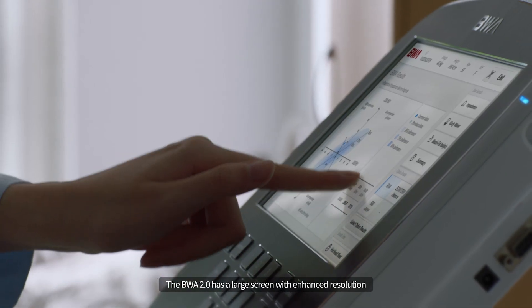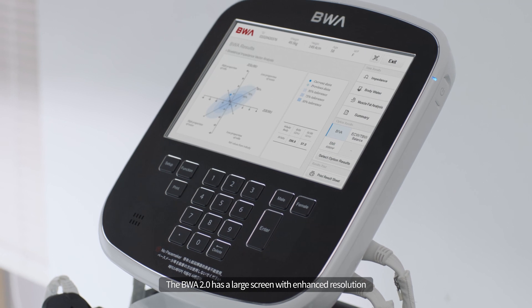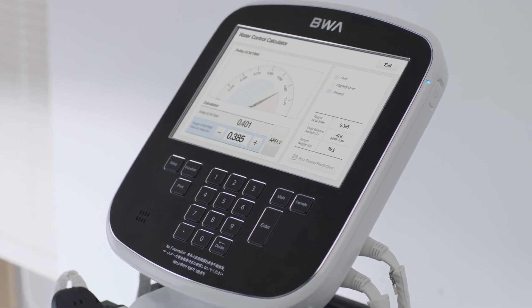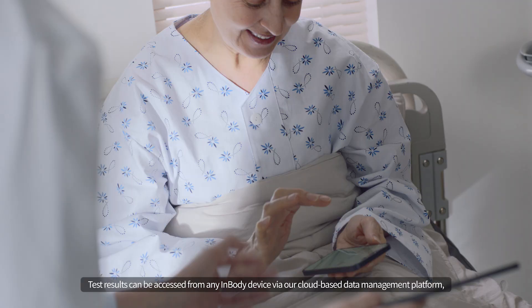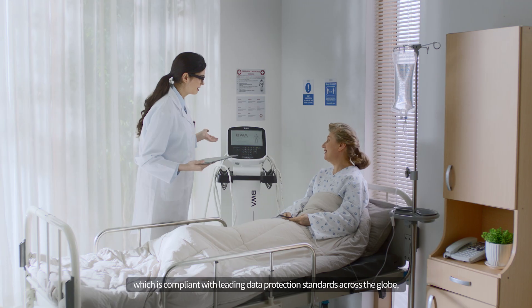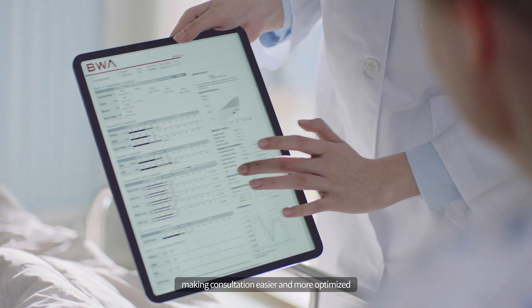The BWA 2.0 has a large screen with enhanced resolution that allows for the monitoring of test results on the spot. Test results can be accessed from any InBody device via our cloud-based data management platform, which is compliant with leading data protection standards across the globe, making consultation easier and more optimized.